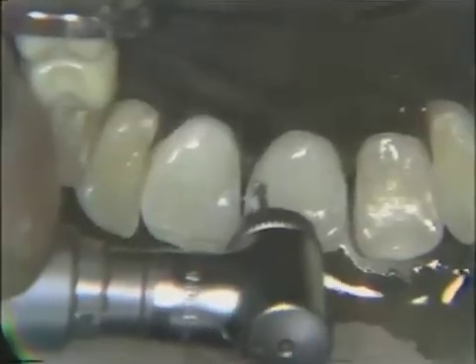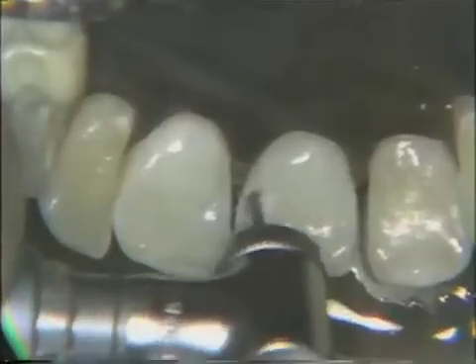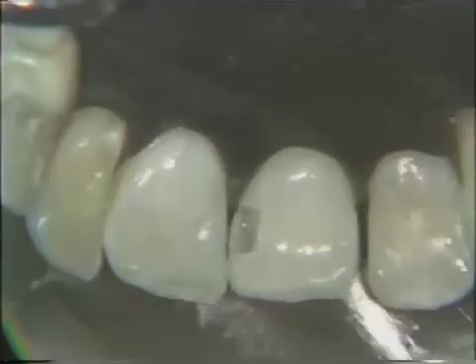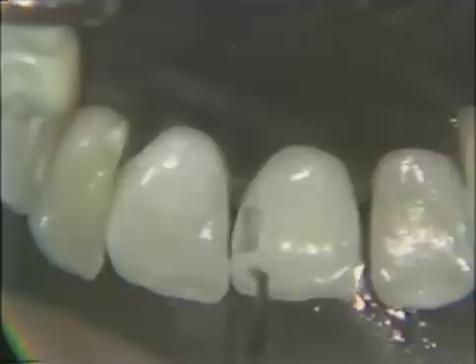There are times in cavity preparations for a composite class 3 that you can get retention only in the cervical and not the labial or incisal, depending upon the thickness of the tooth that remains in those areas. We must not undermine enamel to gain our retention.